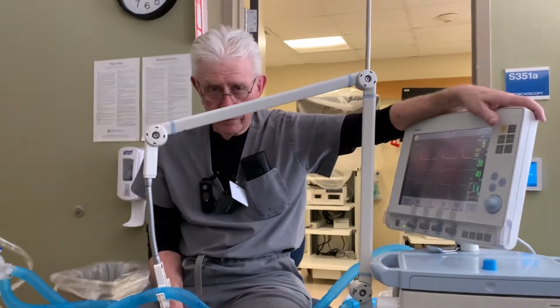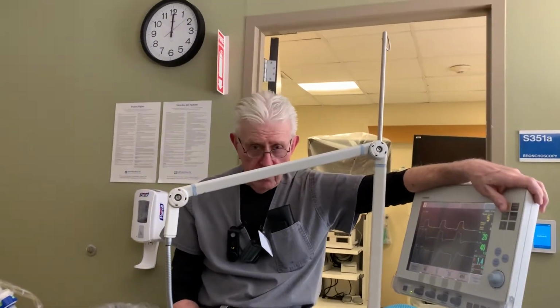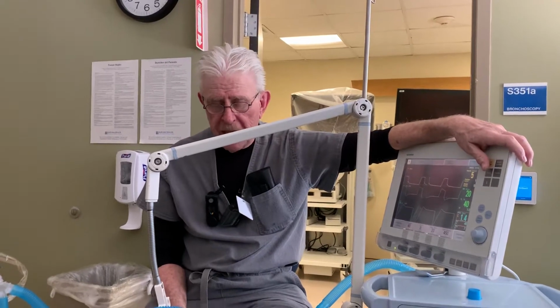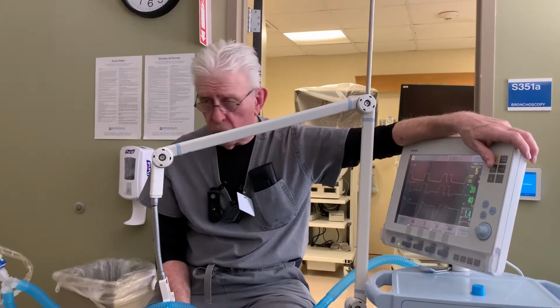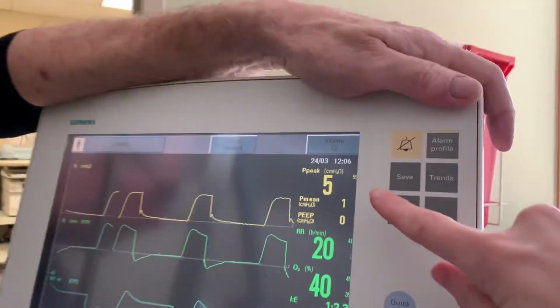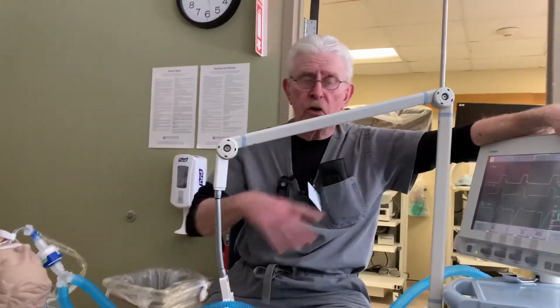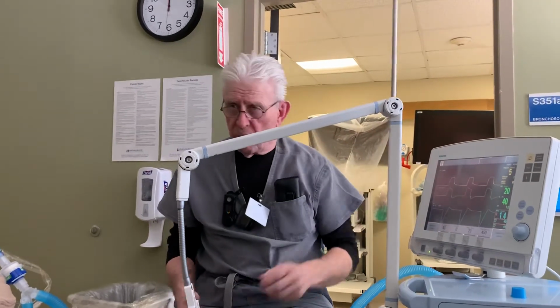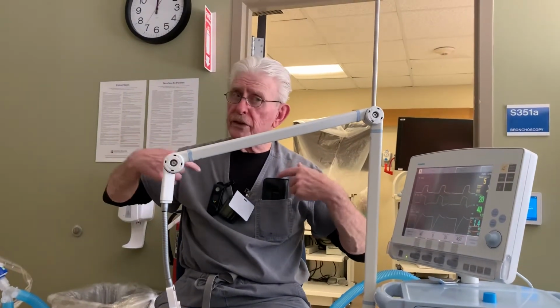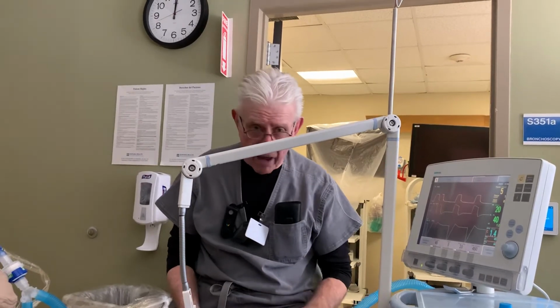A pneumothorax. Generally an unusual circumstance, but possible with mechanical ventilation. That would be an alarming situation, very acute. You would recognize high pressures, usually a high heart rate. You will recognize an instability in the patient, which would then direct you to determining whether or not you're ventilating effectively. For all mechanically delivered breaths, your check is bilateral auscultation of breath sounds, and that should be part of your key to whether or not the patient may have a pneumothorax.